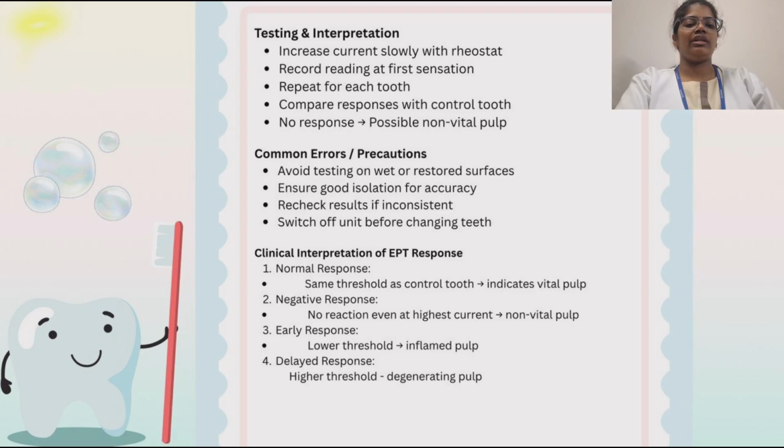Common errors and precautions. Avoid testing on wet or restored surfaces. Ensure good isolation for accuracy. Recheck the results if inconsistent. Switch off the unit before changing the teeth.